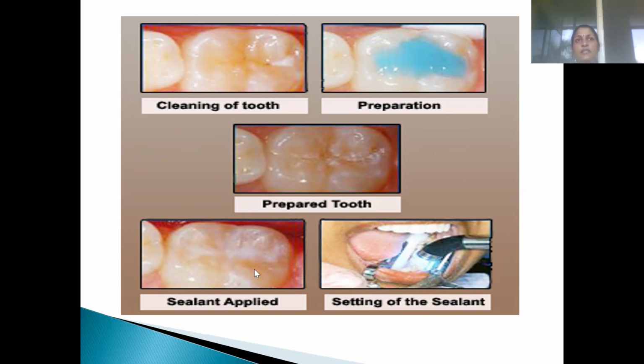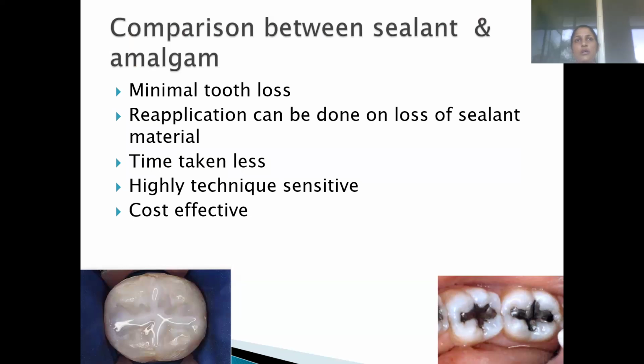After applying the sealant, it's better to run a probe through the sealant to remove the air bubbles, so as to prevent the development of voids. And once you feel that all air bubbles are removed, you have to cure the sealant. Then check for high points and give proper instructions to the patient.